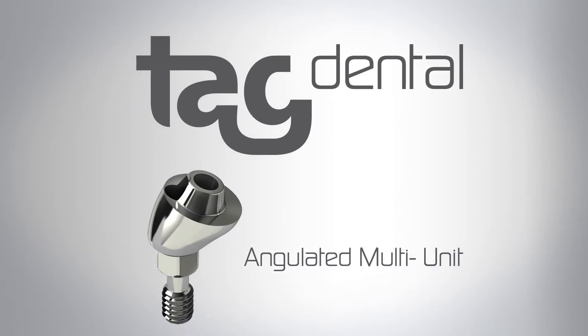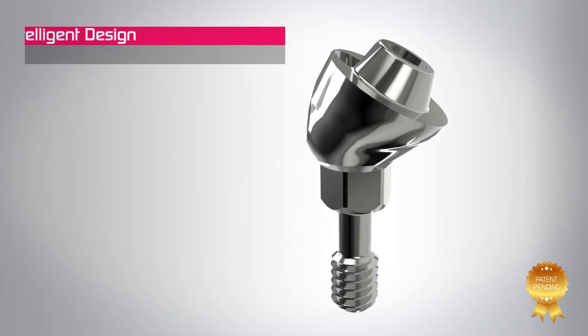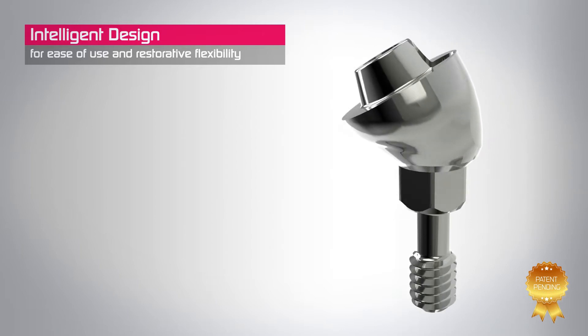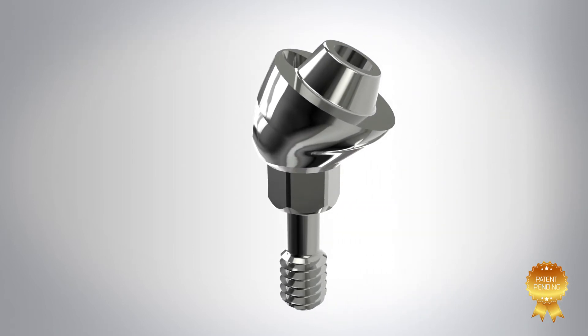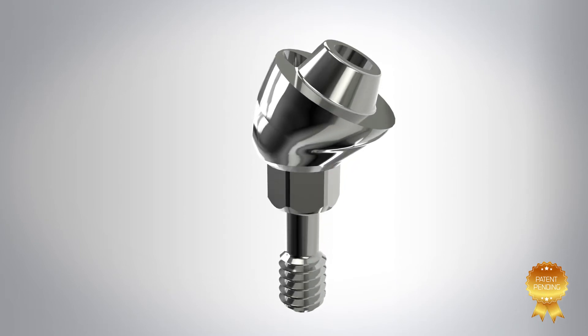TAG Dental, working closely with the world's leading surgeons, introduces our multi-unit abutment system. Made in one piece, TAG's multi-unit abutments feature a reduced size to improve the aesthetic restoration. We provide a complete range of insertion angles and heights for all your patient's needs.